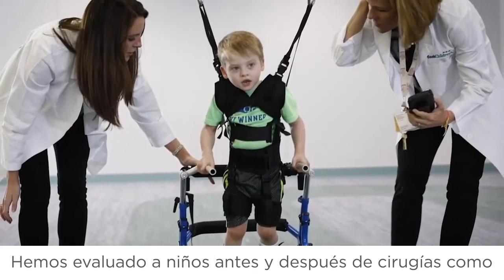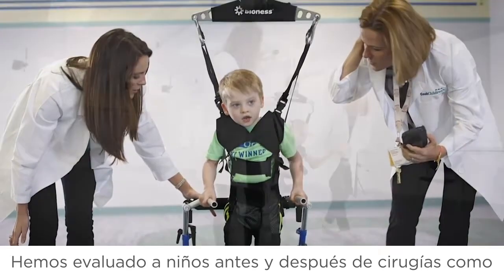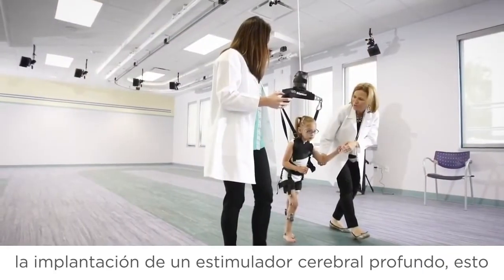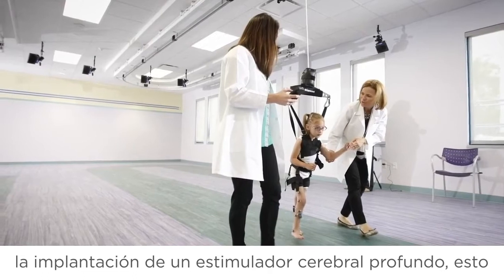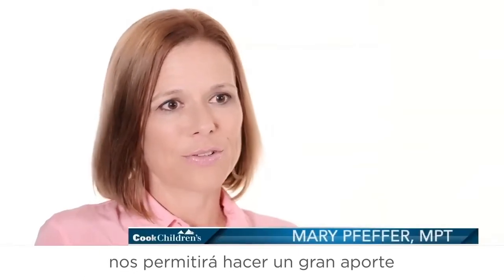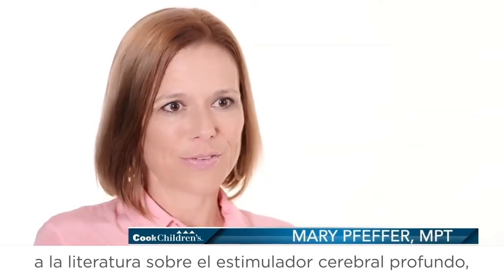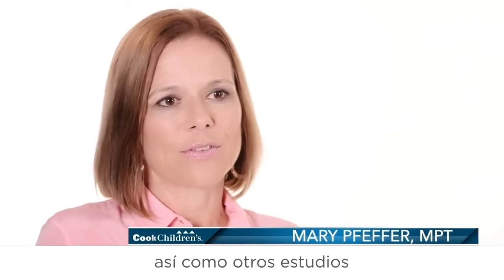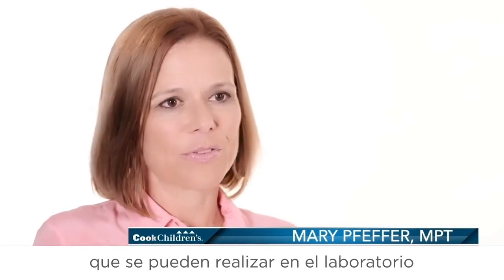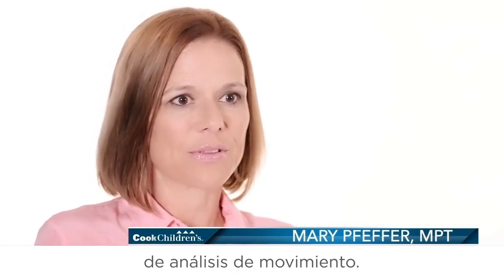We have been evaluating children pre- and post-surgical interventions, such as a deep brain stimulator. This will add greatly to the literature on the deep brain stimulator, as well as the capabilities of what we can do in a motion analysis lab.